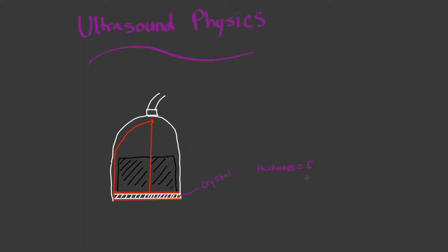So when we go to talk about frequency and its application to clinical ultrasound, you can know that the crystal within the different probes determines what that range of frequencies is. Now within the crystal there's also electrodes. There's the live electrode and then the ground electrode. And these generate that charge coming from the machine. And so when they're applied to the crystal, it starts to vibrate and again generates that sound wave, which then gets transmitted out of the front of the probe.